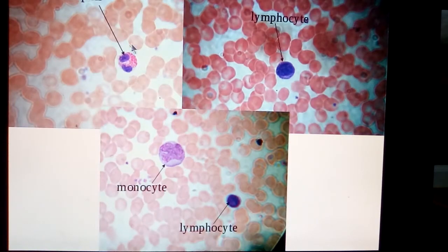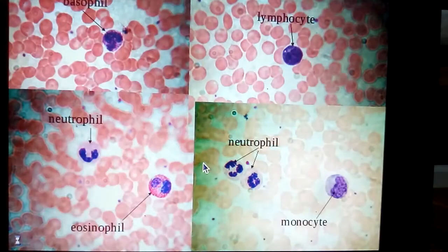Here, this is an eosinophil. See, these are easy. There's that bilobed nucleus, and then you see also pink polka dots in it there. That's the cytoplasmic granules in an eosinophil. Again, they're only about 2% of the cells, and they'll fight off parasitic infections, particularly worms. Another lymphocyte here. You see the heavy oval nucleus, a little bit of cytoplasm there. That one's too blurry. There's a monocyte. It's kind of odd looking, but it's a big cell, big heavy nucleus. It doesn't really look bean-shaped in this example, but it's a monocyte.